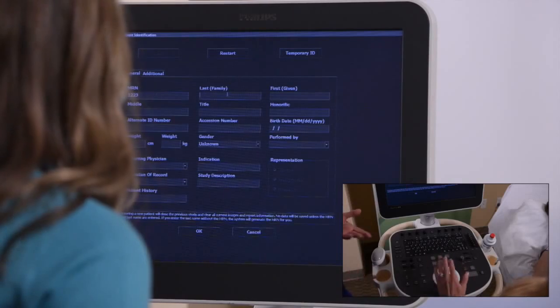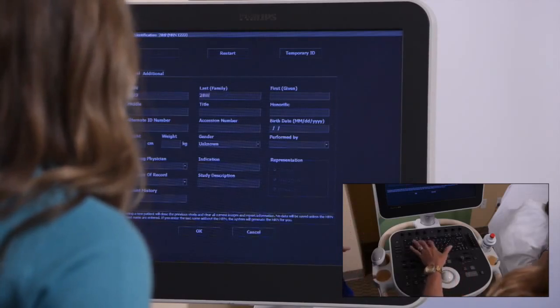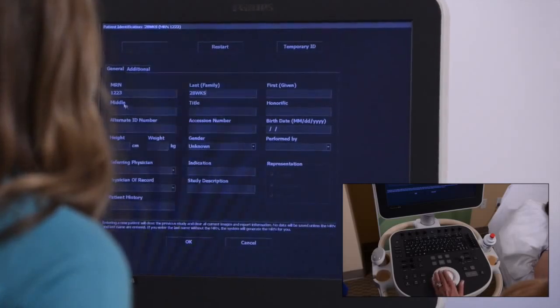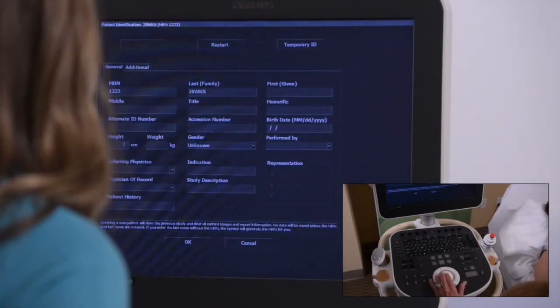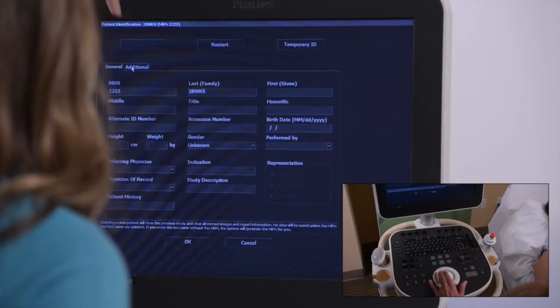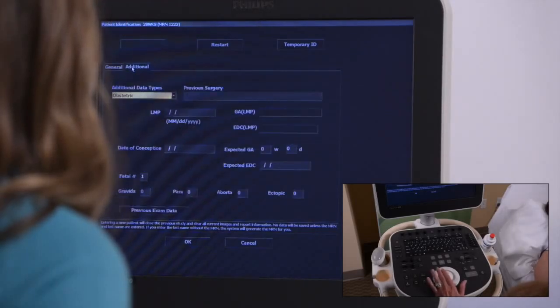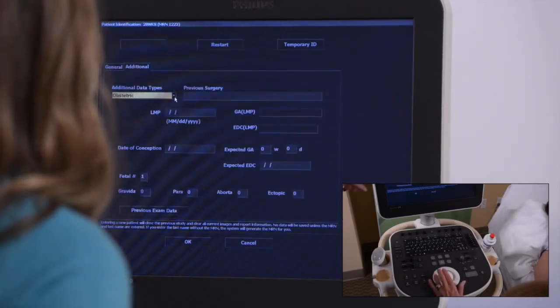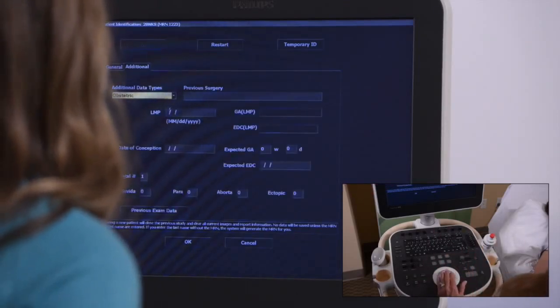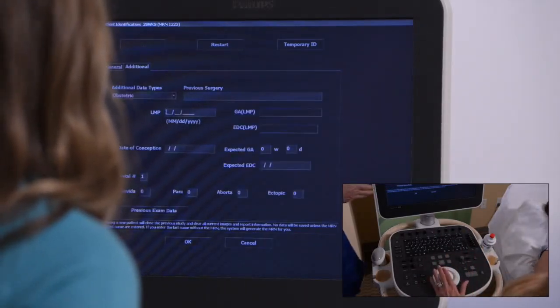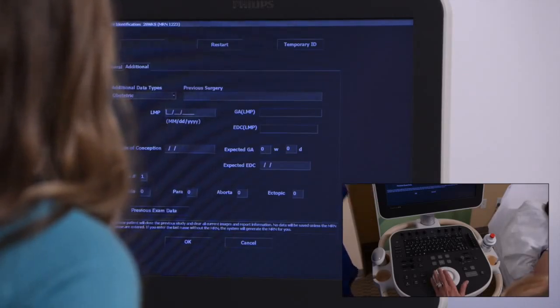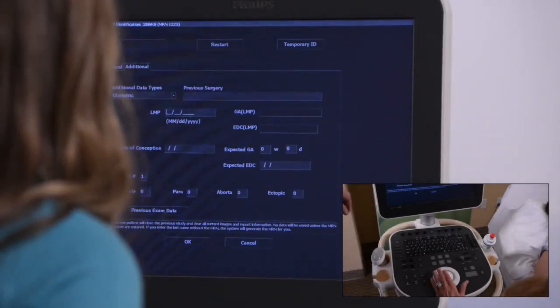In this case we'll put like 28 weeks. We also have all the other identification you would want — referring physician, anything you would want here. For today's purpose we'll just put in the due date under the additional tab. If we were just doing a GYN we could pick that one. Based upon what type of exam we told we were going to do, in this case OB, then it automatically should have brought that up.